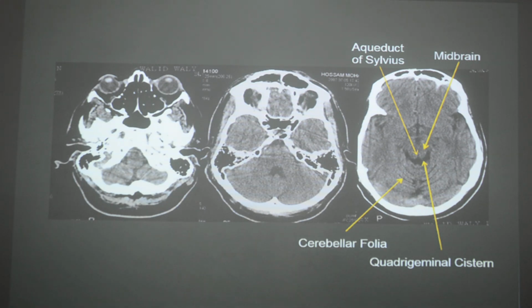I have left an atlas here with labeling of the brain both in CT and MR. For those interested in how the different structures look, because obviously there are thousands of structures in the brain which you can see on both MR and CT, you can go through these atlases. Just remember the basic concepts of how to differentiate between MR and CT. The rest are all labeled in the atlas for you. It's around a 13 or 14 page atlas. It's there on your desktop. Take that home. Go through these images. The images that you remember from your anatomy knowledge, you will be able to see them all on MR. I'll show you the important structures that you can identify.